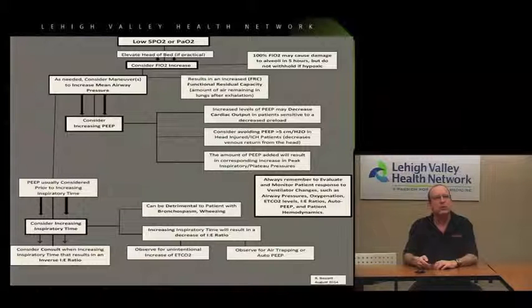So we're having a problem with maintaining our oxygenation. Of course, the first thing we're going to do, especially in our environment, is increase the oxygenation.